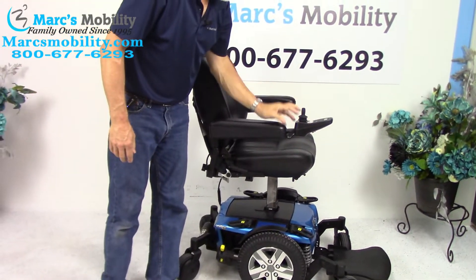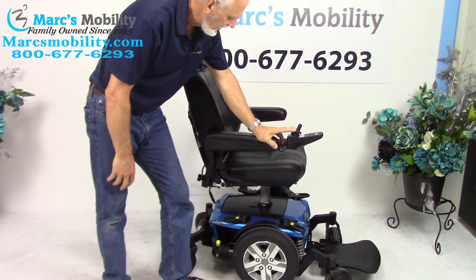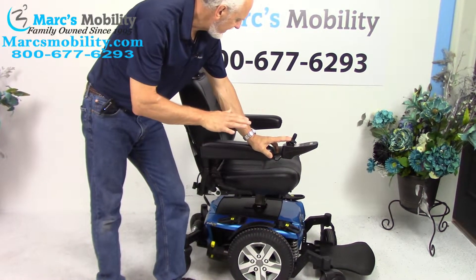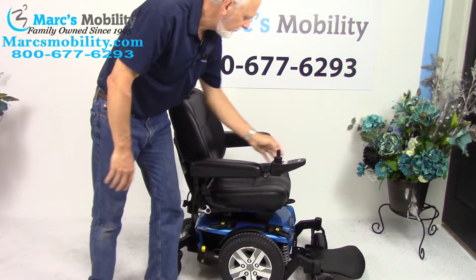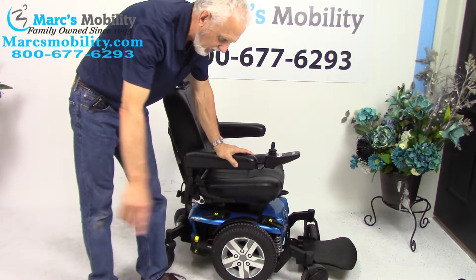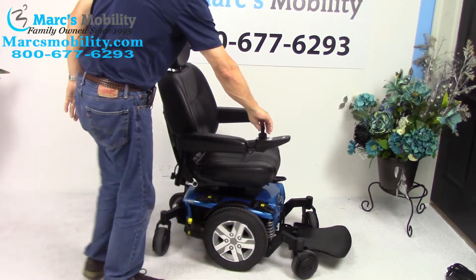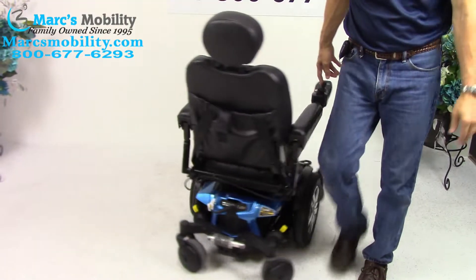Now I'm going to bring the seat back down. This is the 6 inch seat lift going back down. We're going to put it back in drive. This is a mid-wheel drive chair, so it turns around its own length. I can go in a circle like this all day long.